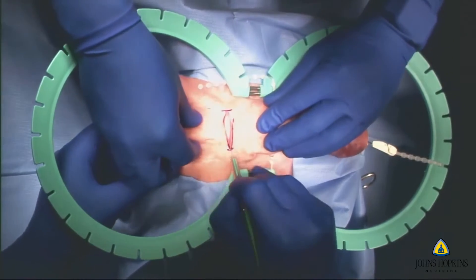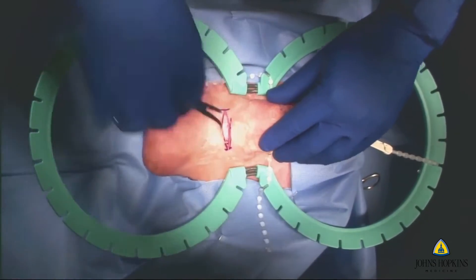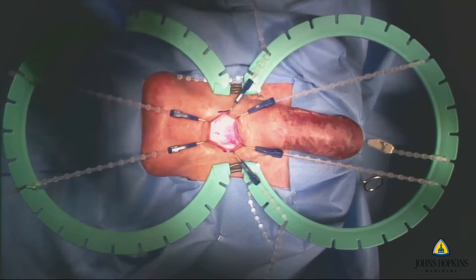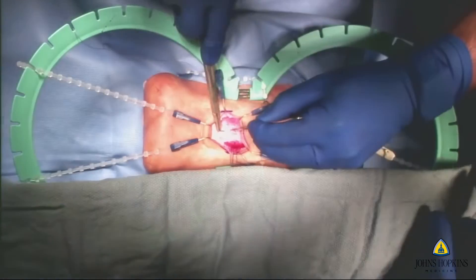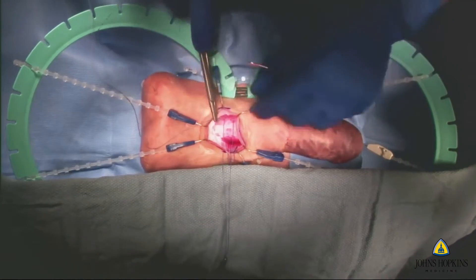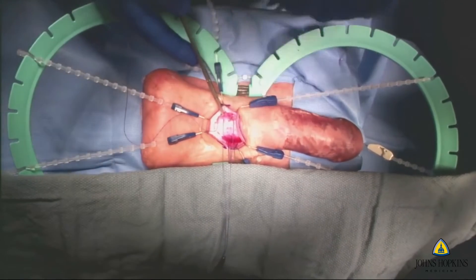Here you can see the simulation starts with the incision. The simulation is prepped and draped as usual. The skin and the retractor is placed and exposed, as is usual during the procedure, because in a true simulation you want to emulate every single step of the procedure. Both corpora are exposed, you can feel the catheter in the urethra, you place your stay sutures, one on each end of the corpora, and then the next step is going to be the corporotomy.